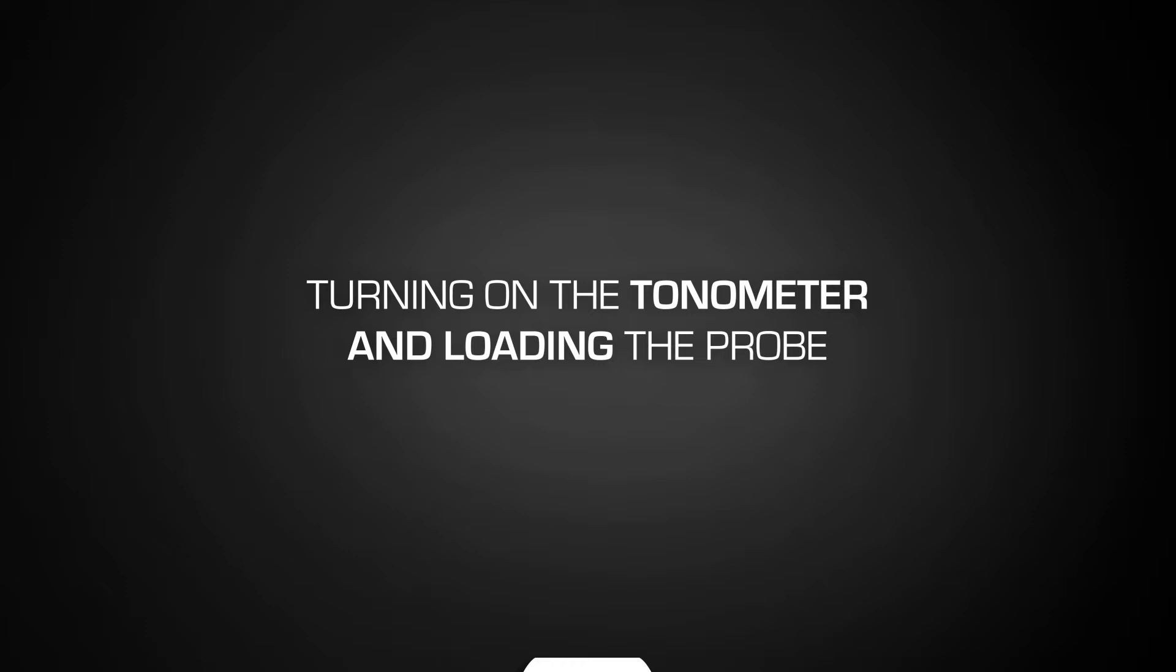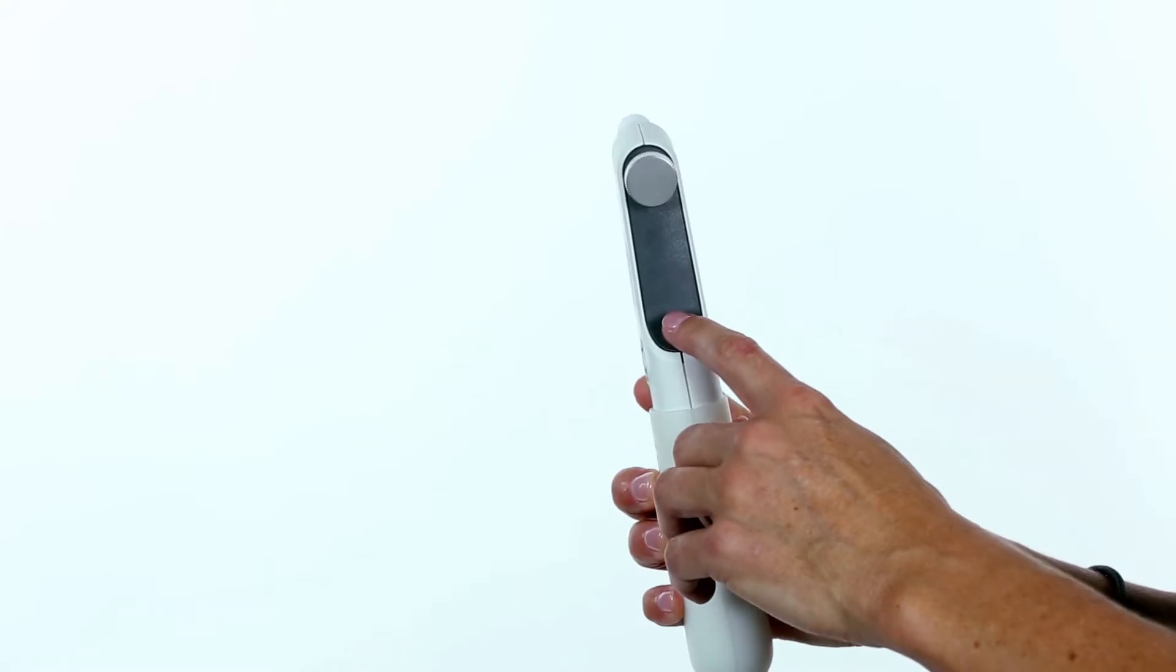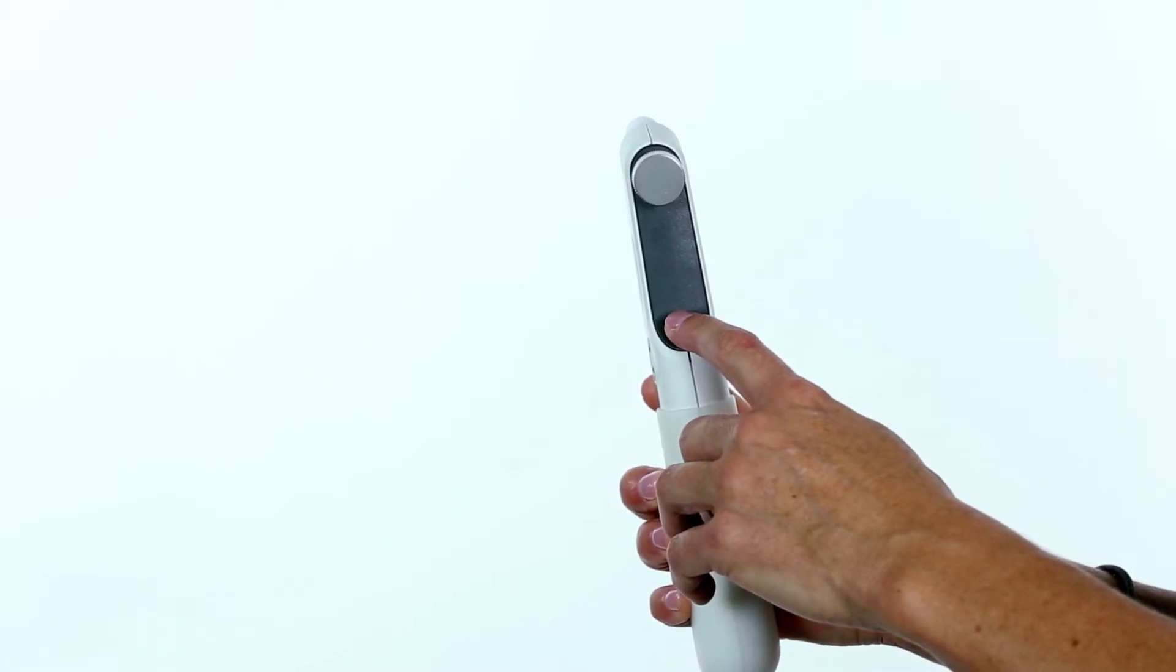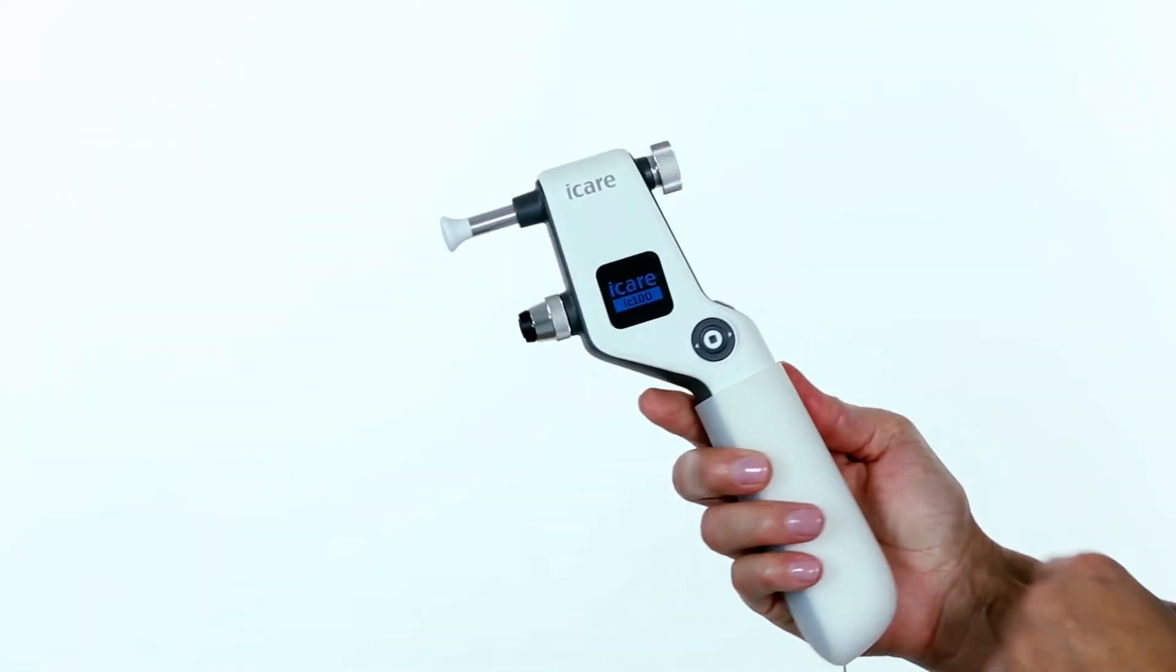Turning on the tonometer and loading the probe. To turn on the tonometer, press and hold the measure button for three seconds, or until you hear a beep.